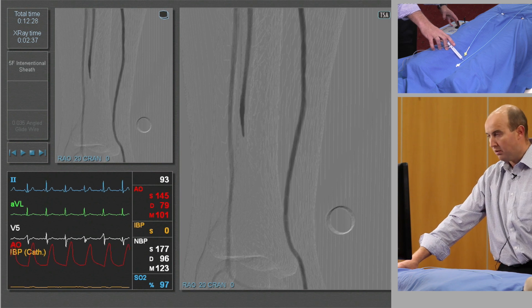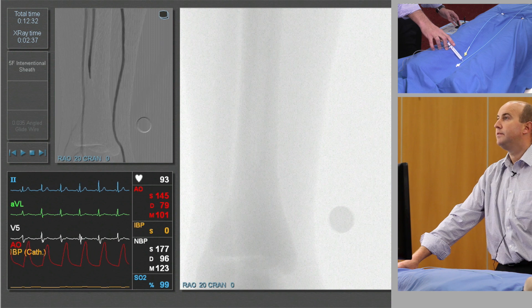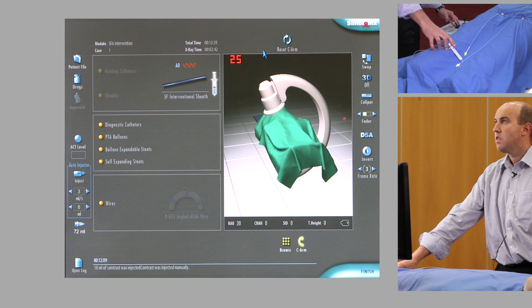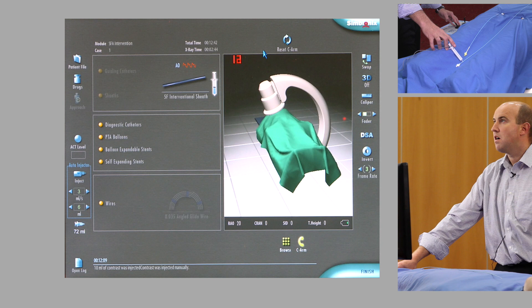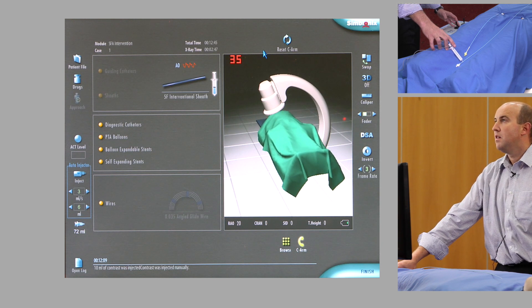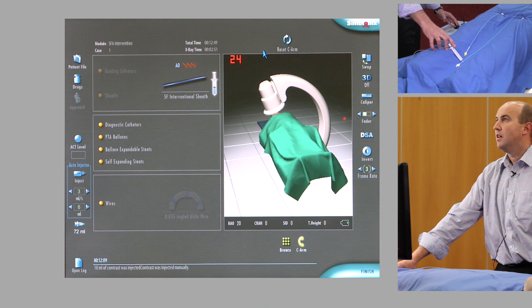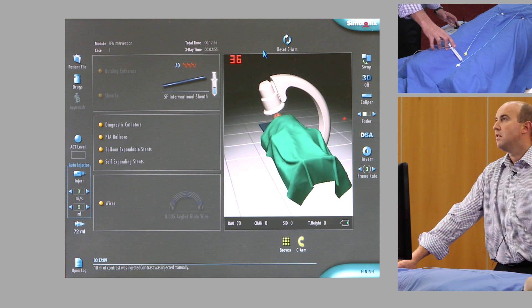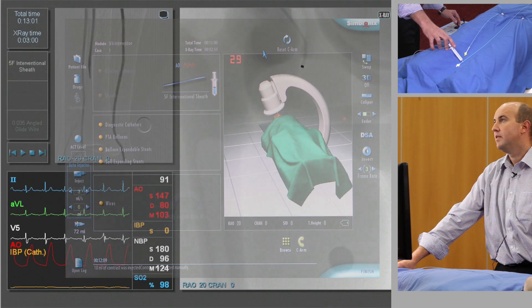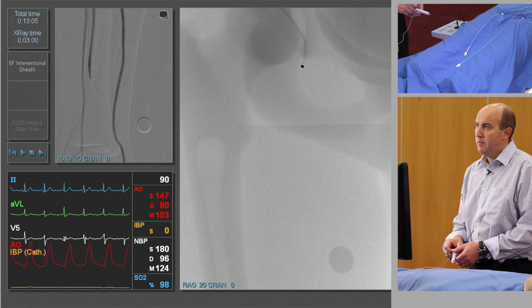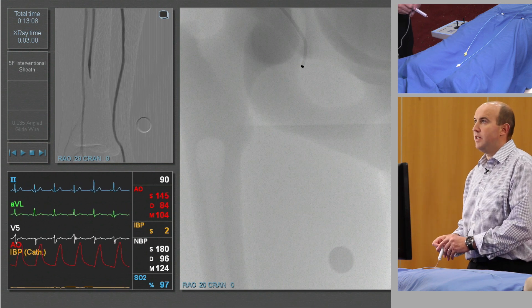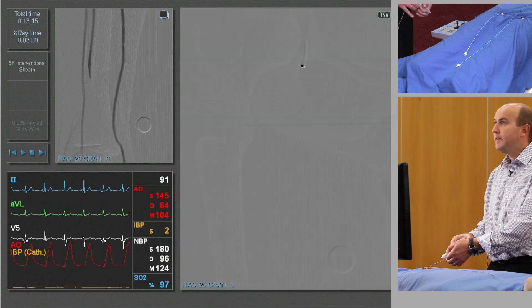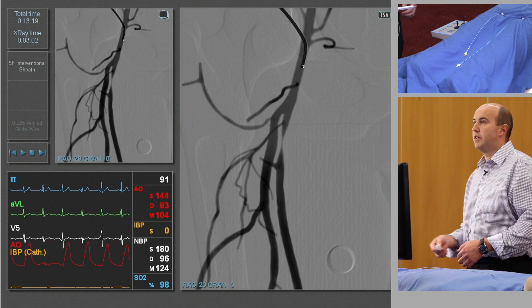Now we move back up to the area of concern. The sheath is at the tip of the screen. We've moved the C-arm, and I'm hoping we don't need to move it anymore. We'll do another run just to show that lesion so that we can take all maps from that — and there you go, center of screen, that's what we're going to be treating.